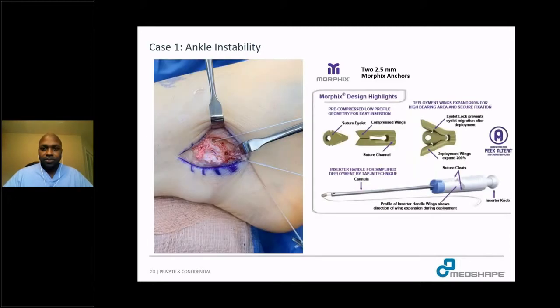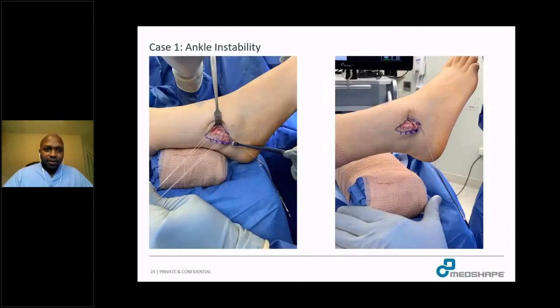In this case, I used two Morphix 2.5-millimeter anchors. In the clinical picture, you can see the placement of the tunnels and the Morphix anchors already deployed. This set of pictures highlights the reason I like to use the Morphix anchors — on the left, the two anchors are in place, and on the right, you can see that I am testing the strength of the anchors by lifting the patient's leg solely by pulling on the anchors. This gives me a lot of faith in the pull-out strength of the implants.